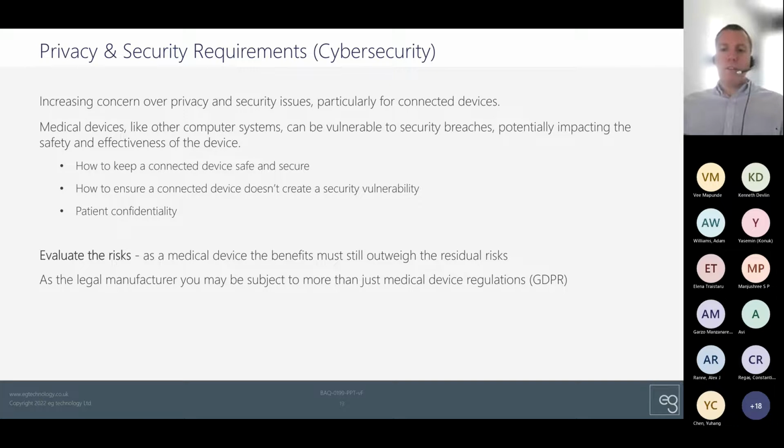So as we've seen at this stage, it's the solid design foundation that's critical, because you need that software architecture that allows you to make changes to the software in a way that's proportionate to the risks and keeps them manageable. As always, before things get too out of hand, you need to take it back to first principles and think, what are the risks?